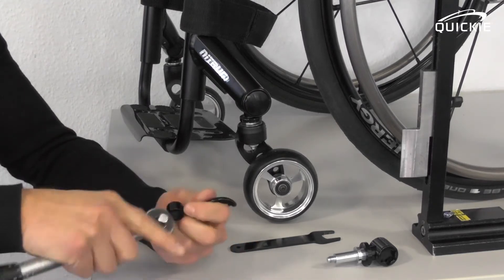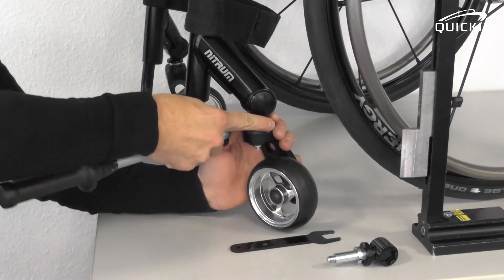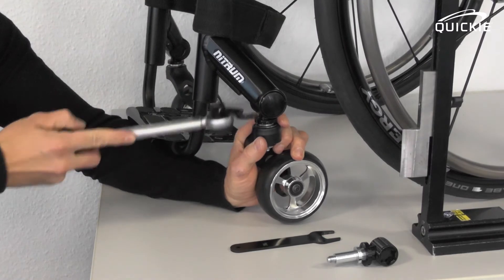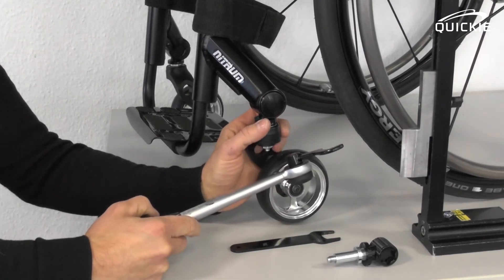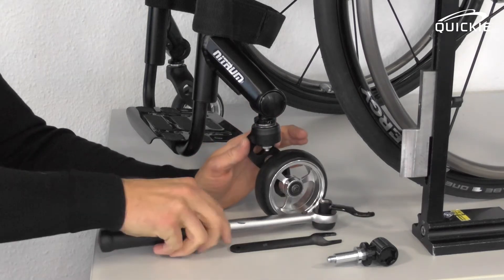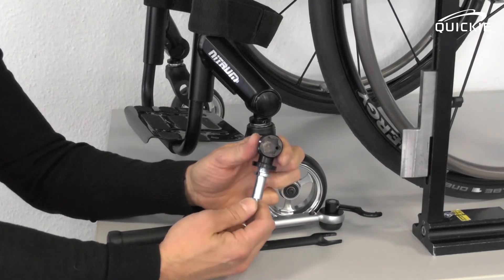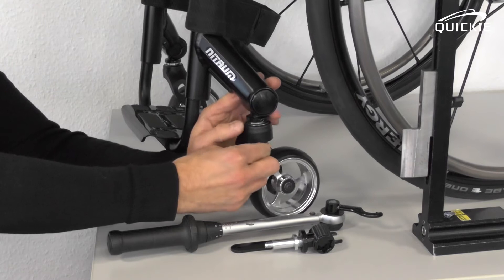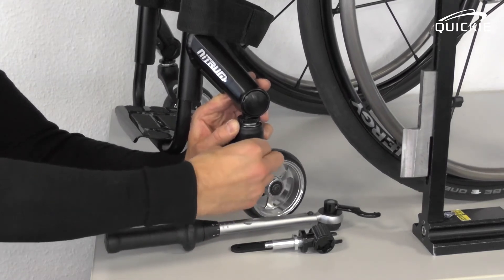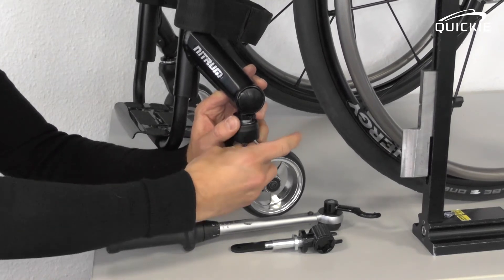Take the special tool, clip it on a wrench, and open the round nut. It can be pretty tight, so you might need some force for that. Once the round nut is opened, you can simply hold the bottom of the caster stem to rotate it. Remember, a 360-degree rotation will add one millimeter to the caster height.